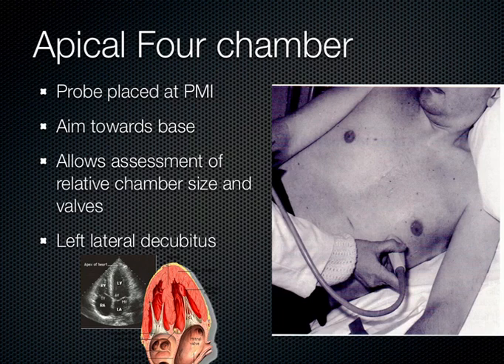Now patients who have chronic obstructive pulmonary disease or who smoke a lot, they lose that PMI, it goes away because their lungs expand to fill that little space. And so this is a very difficult window to obtain in patients who smoke or have chronic obstructive pulmonary disease, or COPD. But this next week with your models, you'll see none of them do that, so they all have really good PMIs. And so this is a pretty easy window to get, hopefully next week.